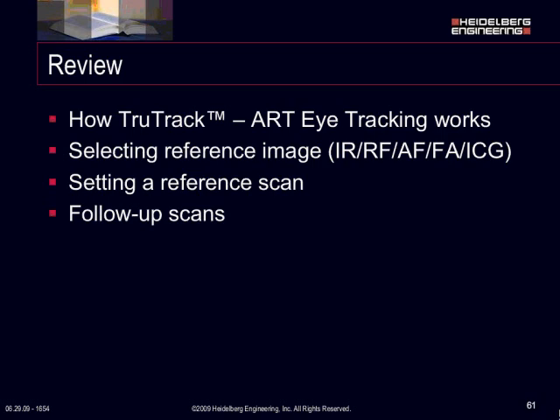And again, you can select your different reference images. If you're doing multimodality imaging after the 5.1 software, once you get the 5.1 software, you can use any type of modality to image your patients with, especially on follow-ups.